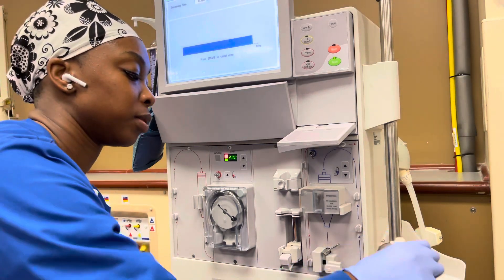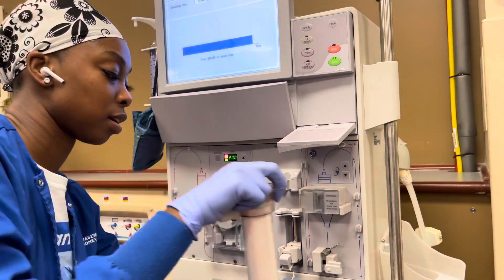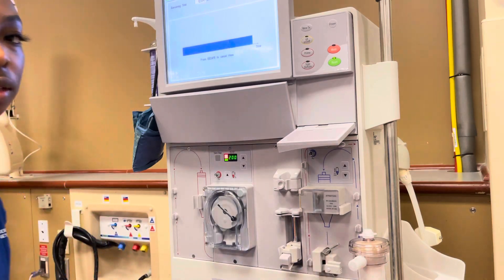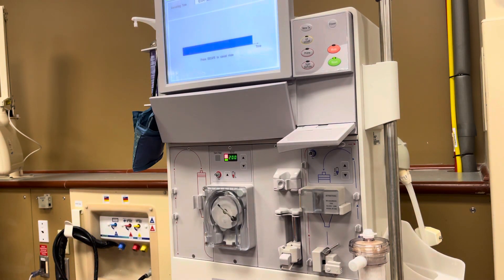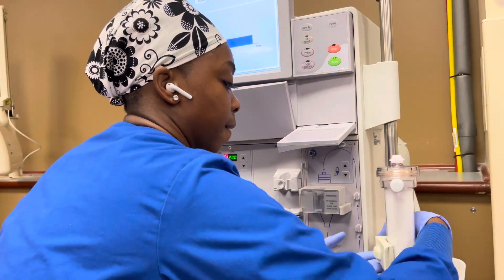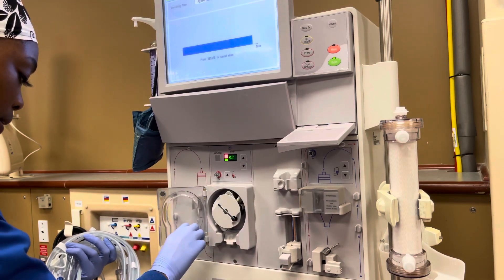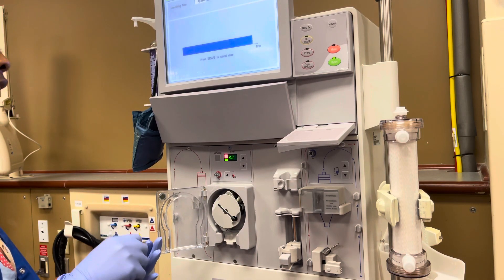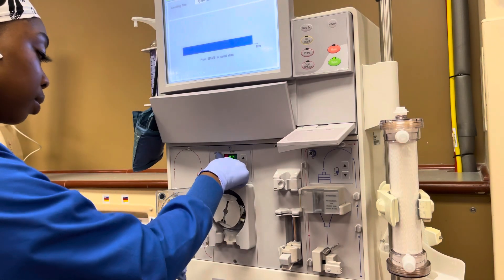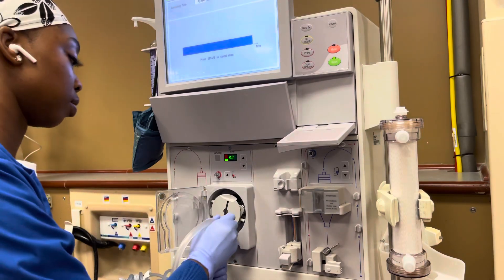Alright, so this is actually the top of the dialyzer, but the way I do mine is I start on the bottom. I'm going to start by putting my — this is your extracorporeal circuit — I think I'm saying the word right.